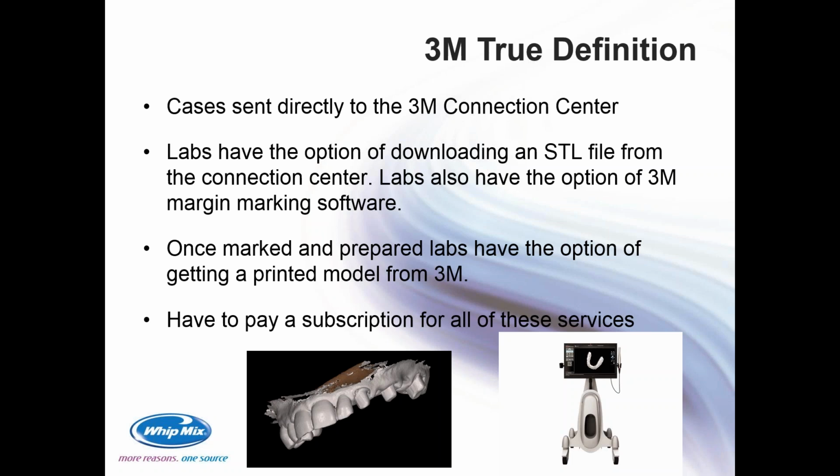And then once the margins are marked, you have the option of getting a printed model from 3M. I have played with their printed models. They have the look and feel almost of a Lego. They're that plastic material of a Lego, and they actually snap in and out like a Lego.